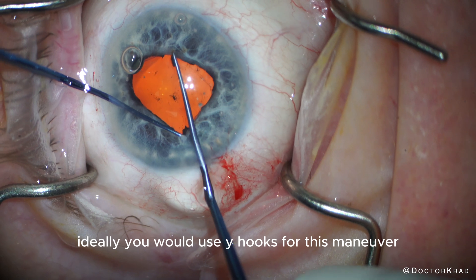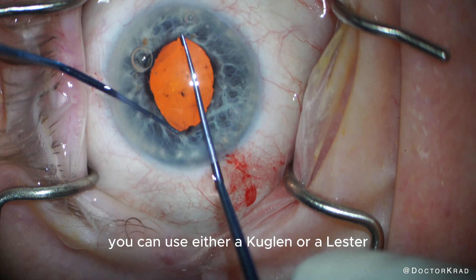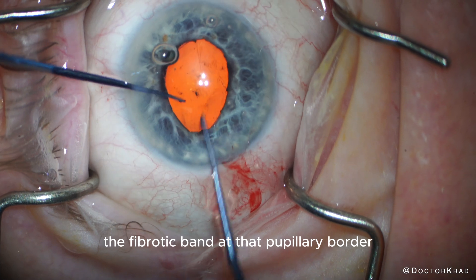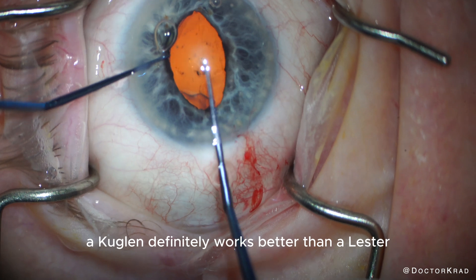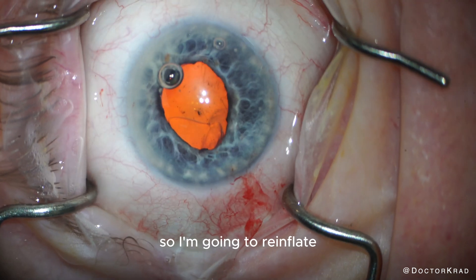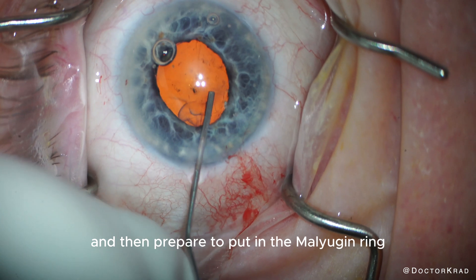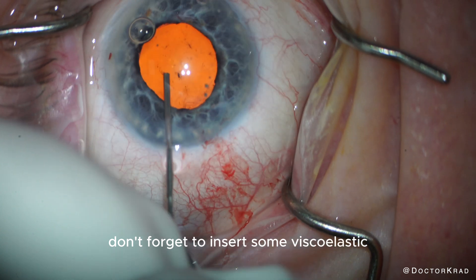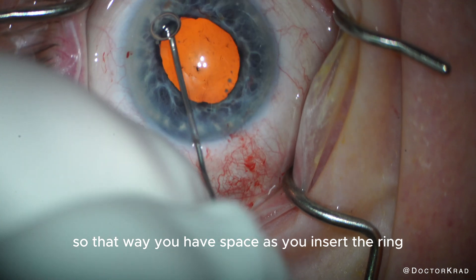Ideally, you would use Y-hooks for this maneuver, but if you don't have Y-hooks at your ASC, you can use either a Kuglin or a Lester. You're just trying to fracture the fibrotic band at that pupillary border. As you can tell here, a Kuglin definitely works better than a Lester. The AC has become very shallow, so I'm going to re-inflate the AC with some viscoelastic and then prepare to put in the Malyugin ring. Don't forget to insert some viscoelastic posterior to the iris so that you have space as you insert the ring.